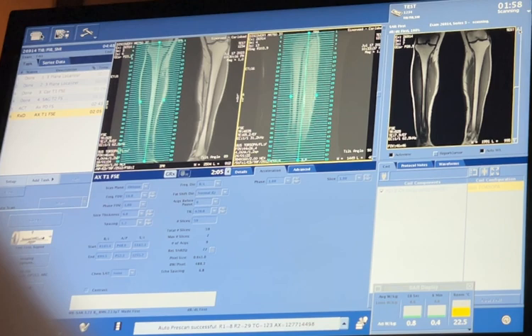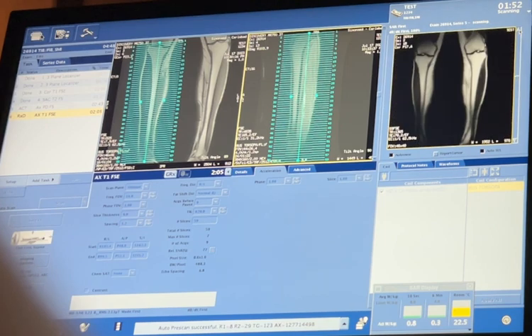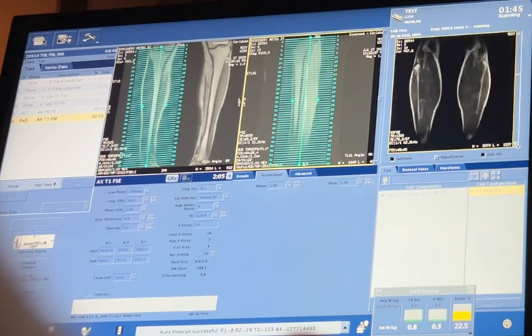For some reason, this coil is crazy. It gets signal outside of its FOV. Like the coil stops up here, above his ankle, and it's getting just about his ankle. It is true.